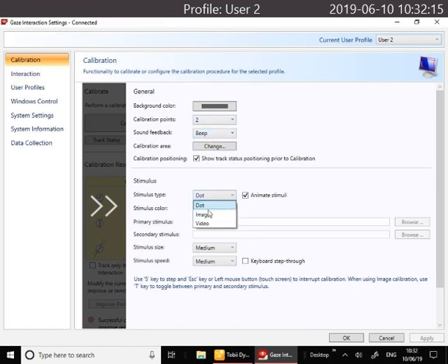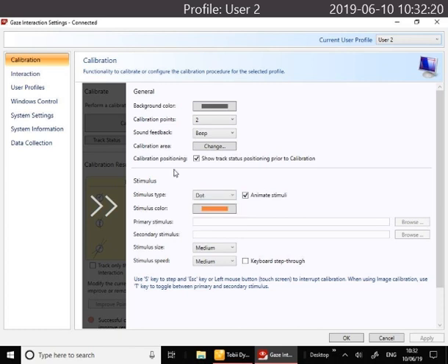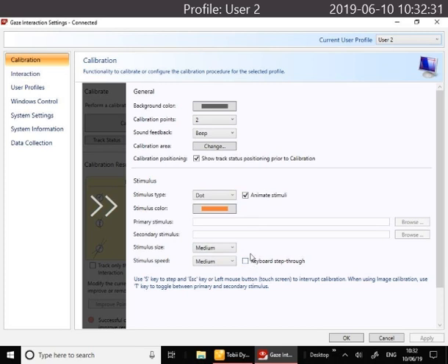You can change the color and the speed in which the dots move around. The keyboard step-through can be really handy for people who you might want to have control of the speed of the calibration, so as you click your keyboard and toggle through the calibration you can check that the user is attending to the calibration process.